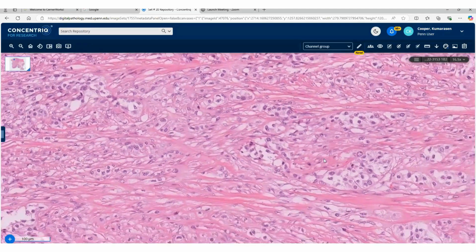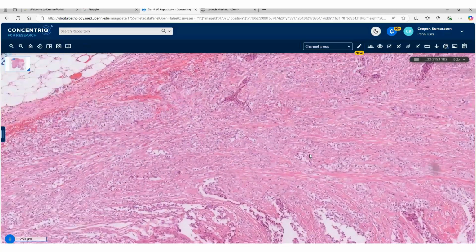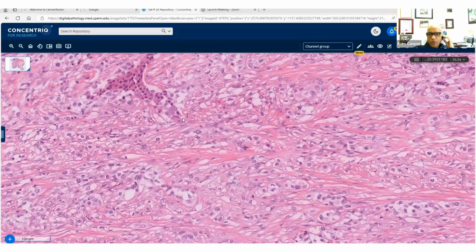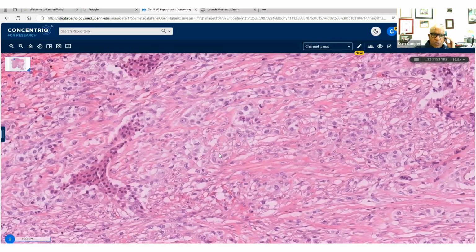Okay, let's perhaps start with getting the epithelial component out of the way. And like I said, it is not epithelial. If you chose to do the epithelial markers, whichever keratin you choose, whether it's a cocktail, my favorite is AE1/AE3. Some people prefer the CAM 5.2, which is a low molecular weight keratin, and others prefer pan-cytokeratin, which is MNF116. Those are all negative, so conclusively not epithelial, just to get that out of the way.